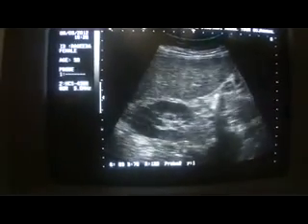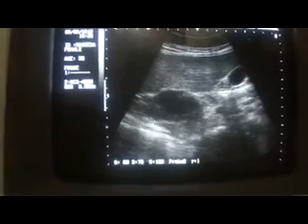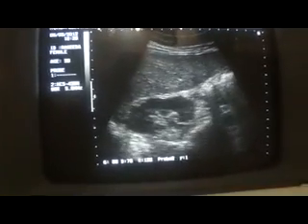So this is now in transverse section, and you can see the renal vein entering the kidney.